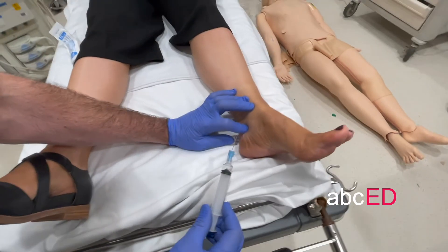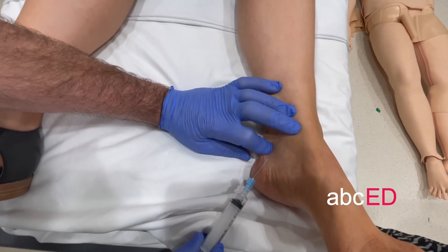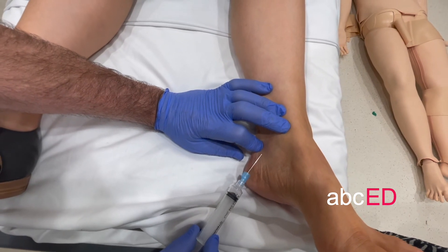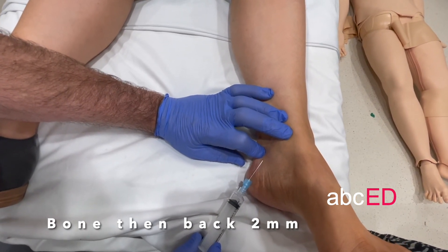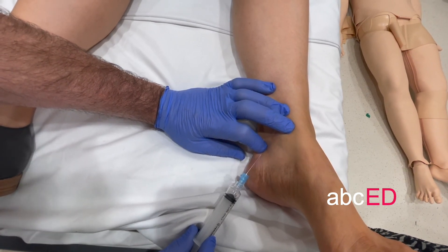You can actually feel the groove where the nerve, artery, and vessels are running. Pop the needle in — you need to go in quite deep, just contact the bone, then come back a couple of millimeters, and again inject five mils. That will block the posterior tibial nerve.